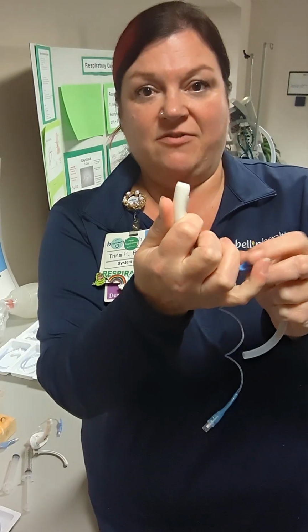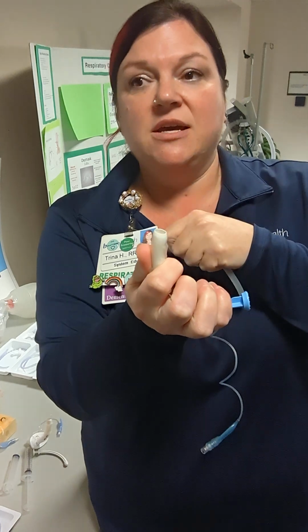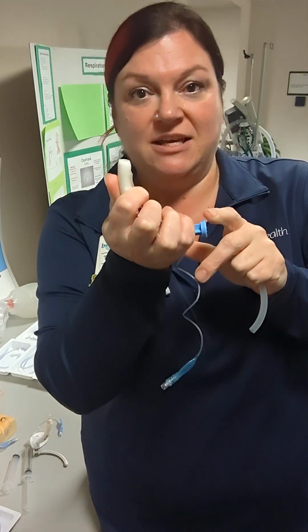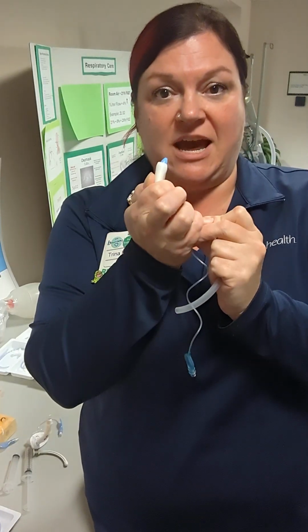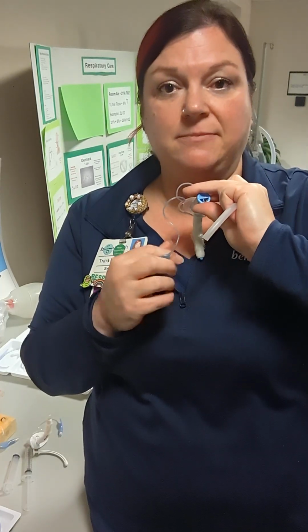If we did not have that, you can see how this is very blunted. It's actually quite sharp, similar to a melon baller or an ice cream scoop. If we drag this along their tissue, we are going to cause them damage. So we need to have the obturator inside before we attempt to place the airway.